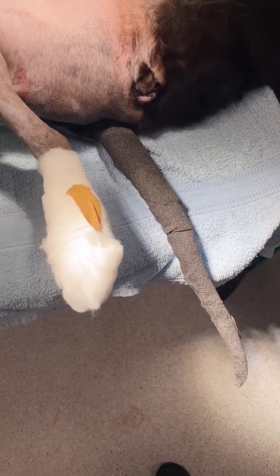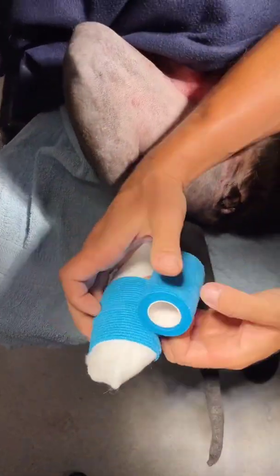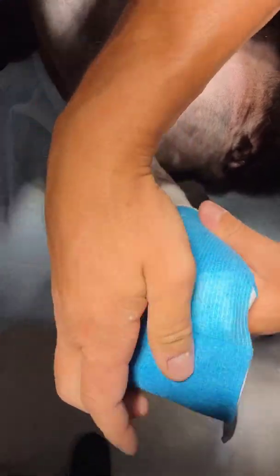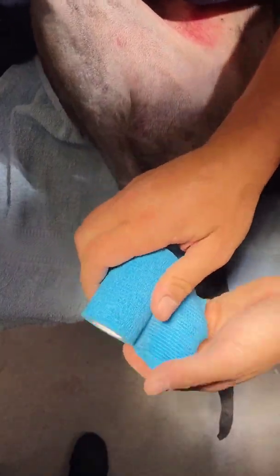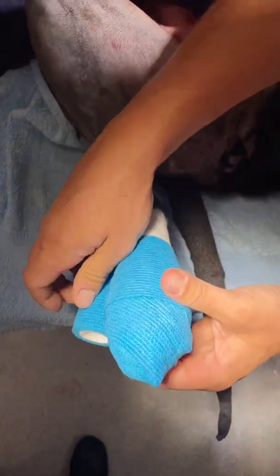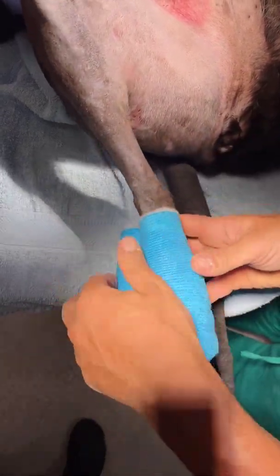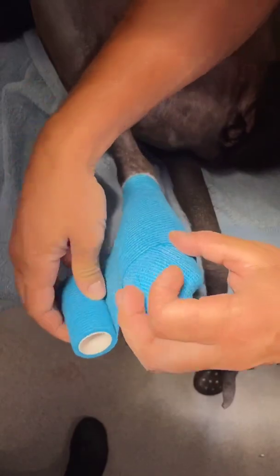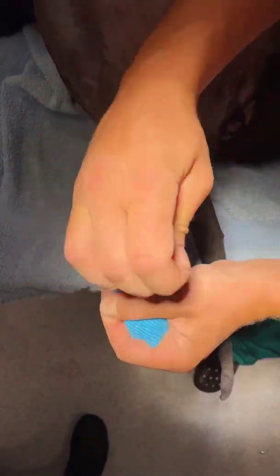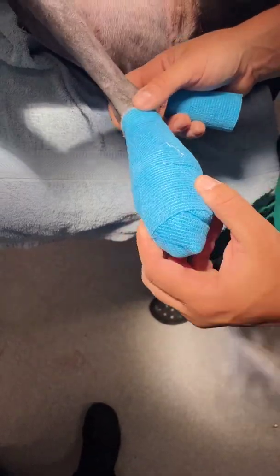We're gonna put some vet wrap on here now. I'd just like to do a double wrap to start, beginning down near the bottom of the foot and then coming up over the foot. The bandage should always look nice, neat, and uniform — if you've got a lumpy bandage with inconsistency in it, that's likely to create pressure issues. So I'm just gonna wrap that around one more time and finish that off. Those stirrups are gonna keep it on there very solidly — we don't need any Elastoplast to try and keep it on.